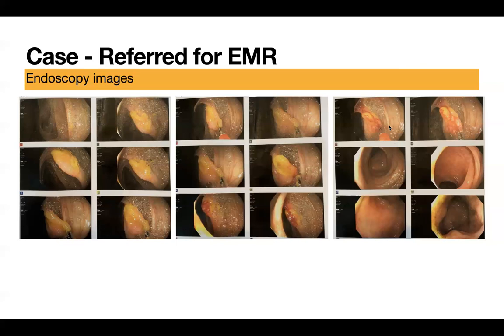So for the research project that you're discussing, you were our blinded expert. You didn't know who the endoscopist was, but if they took pictures of what they called cecum, and it was clear to Bill and myself that it was cecum, then we included it. If it wasn't, then you were the expert that was going to reconcile it. So tell us your thoughts on that.